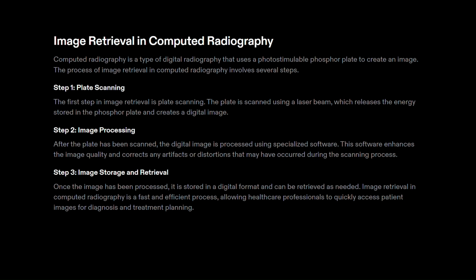The image retrieval in computer radiography. We have seen the various methods used for image processing. Now, image retrieval. The first step is the plate scan. The plate is scanned by a laser beam, which releases the stored energy in the phosphor plate and creates a digital image.